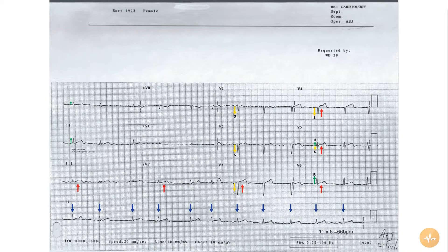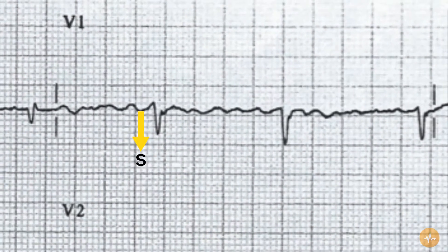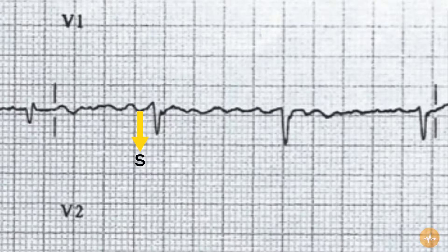The irregular baseline in lead V1 is chaotic and represents fibrillation waves, and shouldn't be confused with the much more regular patterns seen in atrial flutter in some cases.